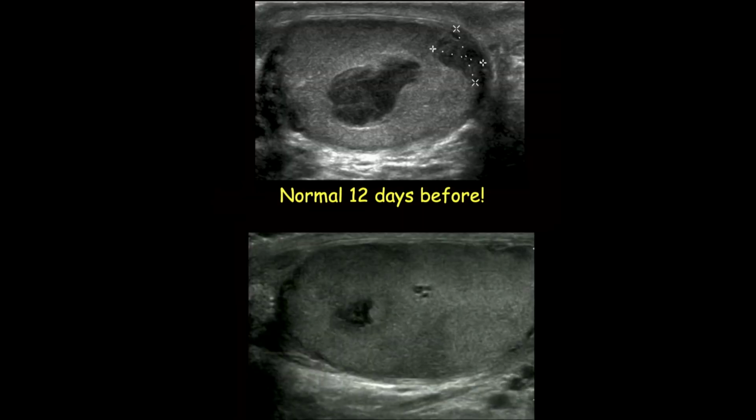And this is back where the scrotal sac is attaching to the perineum. Put a needle in there, and frank pus came out. So learn from my mistakes. Look at not only the testicle and the epididymis, but look at the whole scrotal sac. This is an abscess, complication of epididymitis.